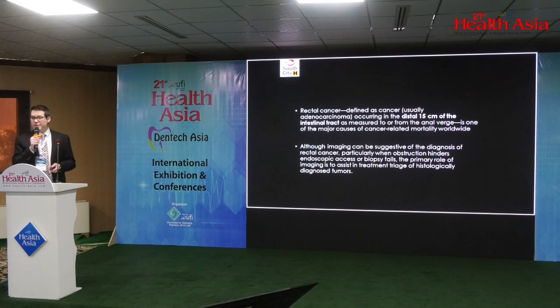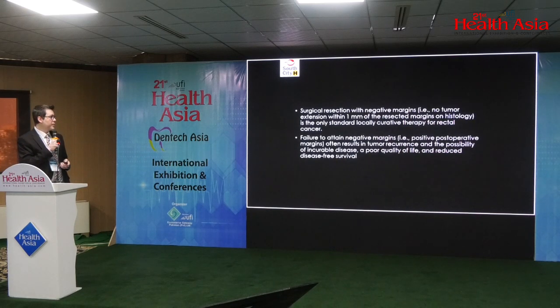Although imaging can be suggestive of cancer, especially in patients who come in with intestinal obstruction or who have already had problems before, usually MR staging or radiological staging is used for patients who have already been diagnosed as having rectal cancer, and they come to you primarily to assist in triaging what the appropriate line of management would be for patients who have rectal CA.